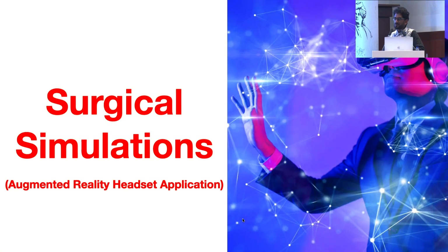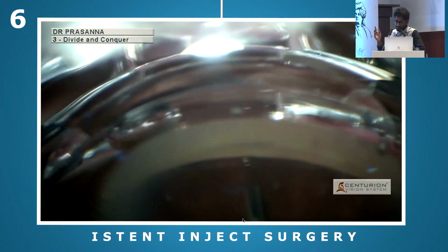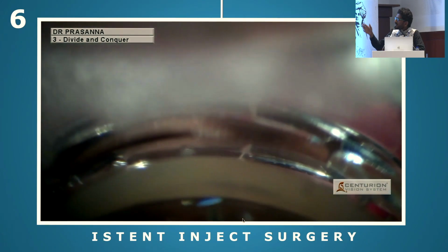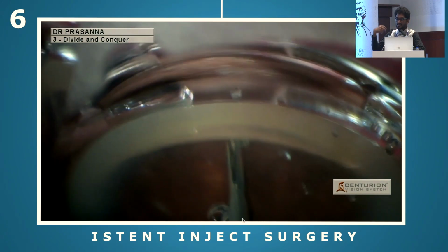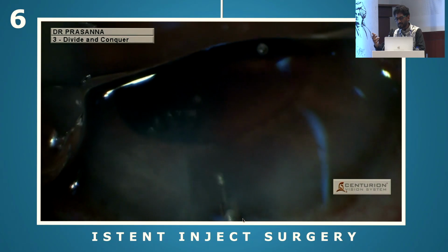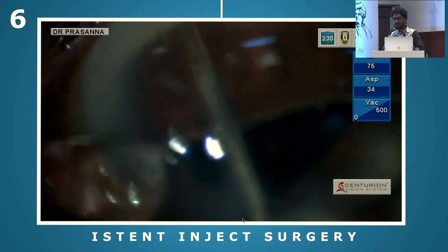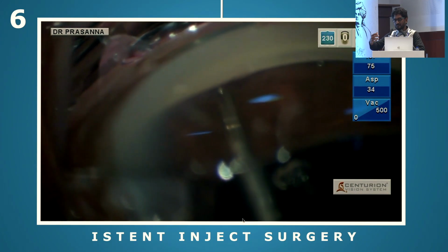Moving on to the third part, migrating into the surgical simulations. This was an idea I got when I was doing one of my MIGS cases. The stent was superficially implanted. This was a 2022 case of mine where I had to place the second stent first. Then I had to reassess the implant that was hanging because it was under-implanted. I was almost losing it in the phaco wound, because at that time there were not many teaching modules in 2021 when MIGS were hitting India. So all's well that ends well, I was able to recover the stent and then place it well.